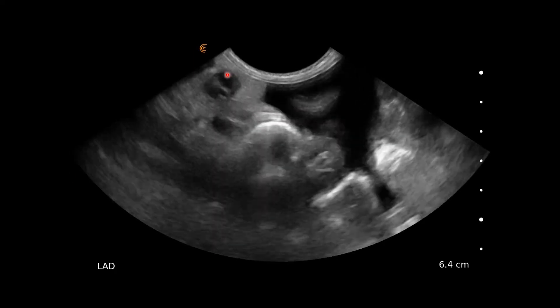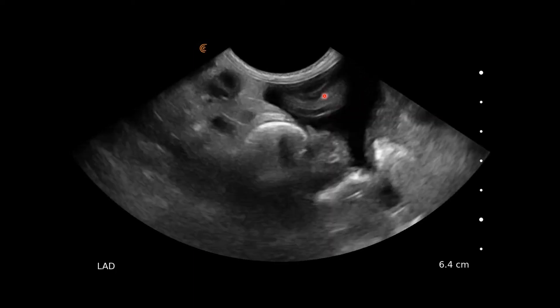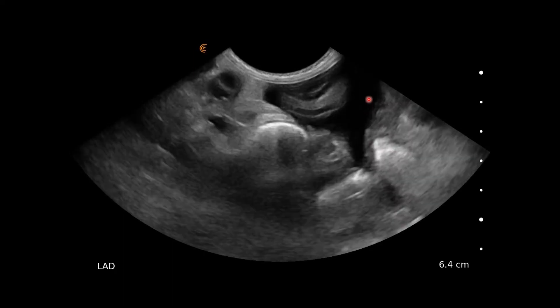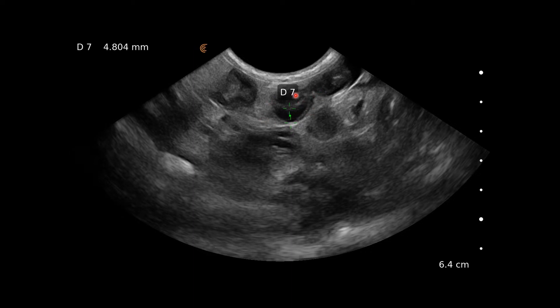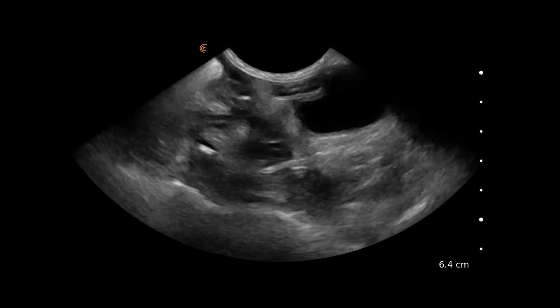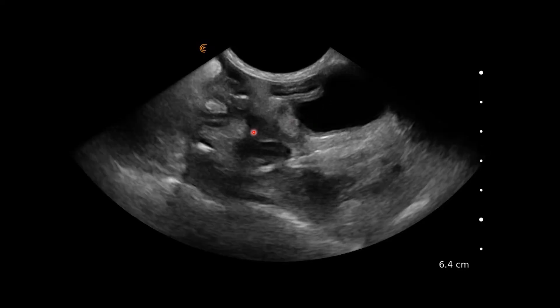Now we're looking at the duodenum. We've got a transverse loop of duodenum here and we can see some peristalsis in this loop of intestine. We can also see free fluid in the abdomen around the intestines. Measuring the duodenum wall — it looks very normal with a thick mucosal layer and normal submucosa, muscularis, and serosal layers. At just under five millimetres it's slightly thickened, but the wall looks much more normal than the stomach wall. More loops of duodenum show that surrounding free fluid.